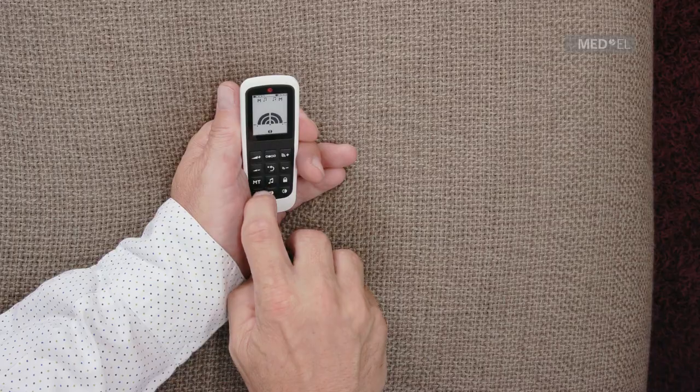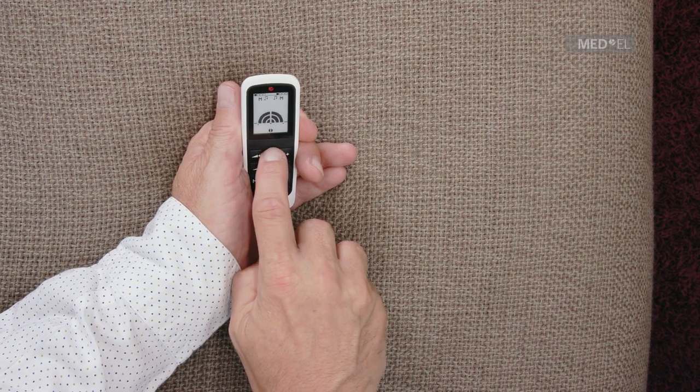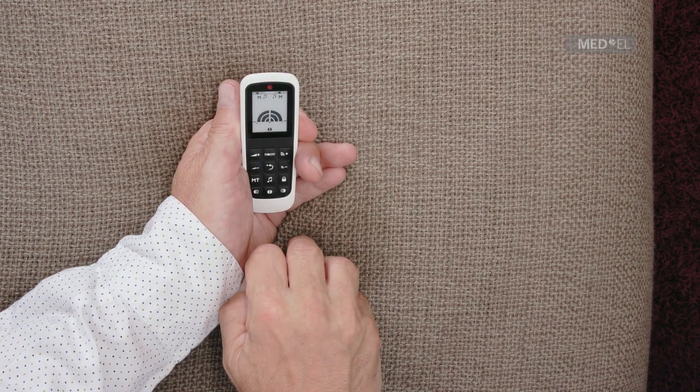To select a program, press the program selection key. The bar at the top of the screen indicates which program you are currently using.